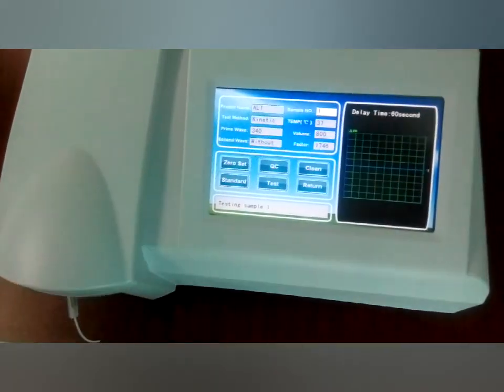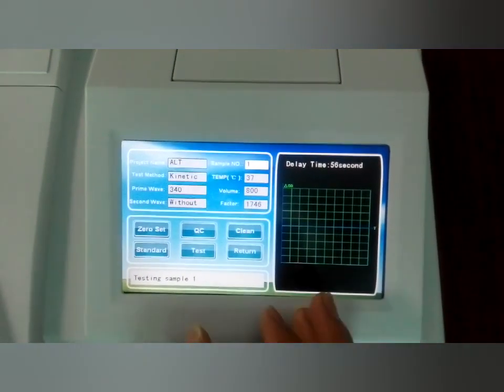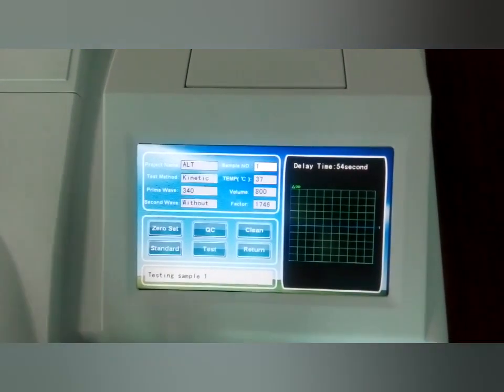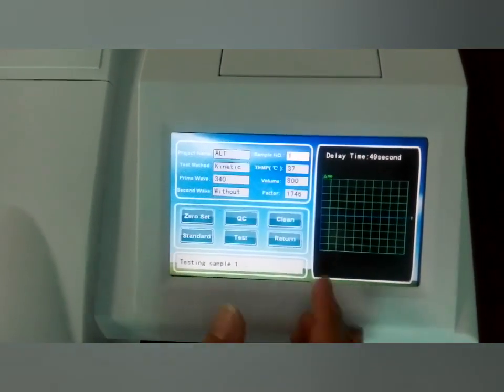This is all. Then when we wait about 16 seconds, we will get the result. To save time, we can return.